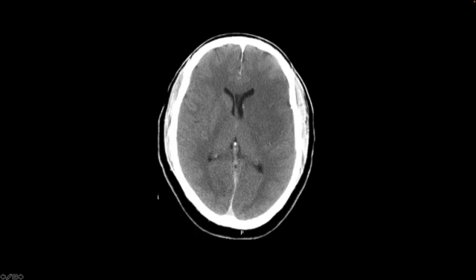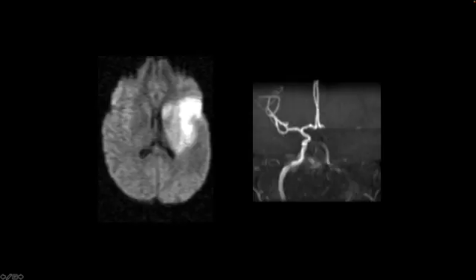The left side is abnormal and all of this stuff is kind of the same gray density here. We can't make out the caudate head. We can't make out the putamen. We can't make out the internal capsule or any of those structures that we can see on the right. And so this is obscuration of the lentiform nucleus, highly suggestive of a proximal occlusion in the middle cerebral artery on the left, blocking those perforating branches that supply that region.